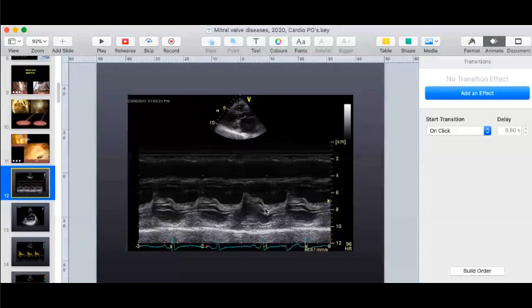Now, just a brief comment about the M mode itself. What is the characteristic of M mode? What is the advantage of using M mode here? Temporal resolution is very high, sir. Okay, so how high would you say? So anywhere from around 2000 to 3000 frames per second. So that is how high the frame rate of the M mode is. So that's the reason why it is used for these sort of findings which need to be identified. So that is the importance of M mode and what is unique about it.